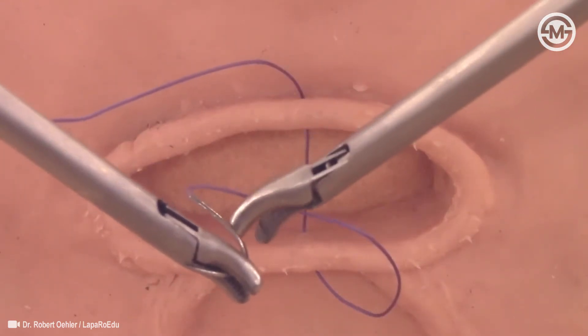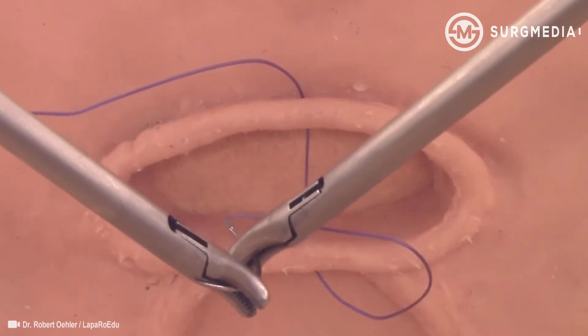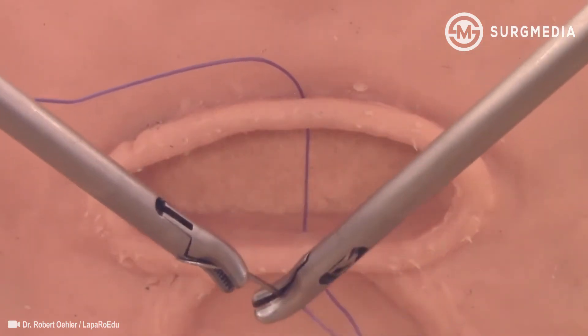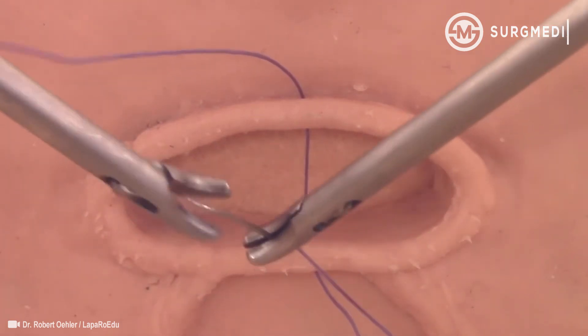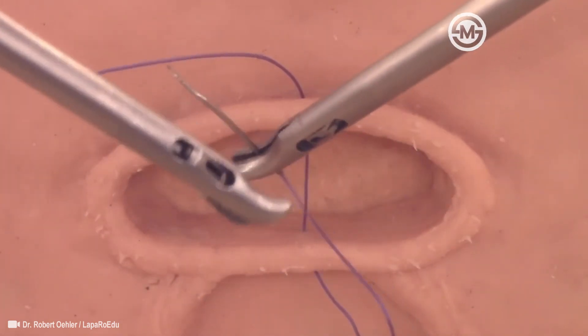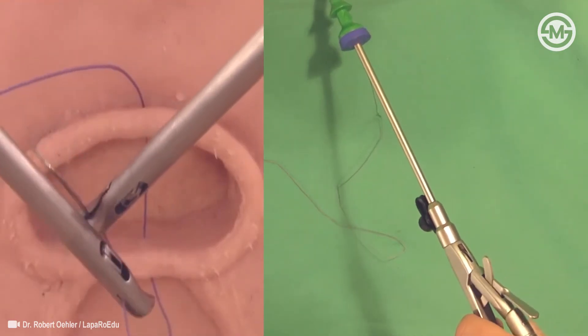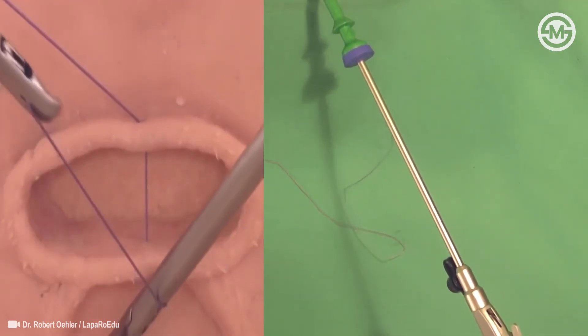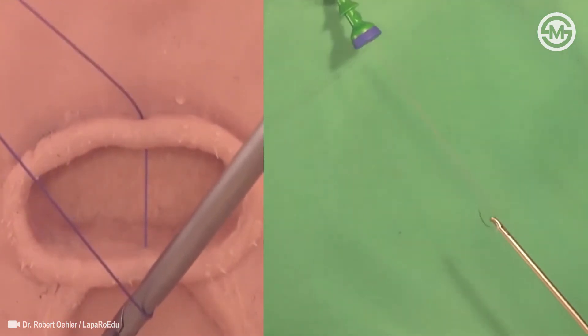Any large needle must be bent straight before extraction through the trocar. Forceful rotation of only the right needle holder will bend the needle sufficiently. The left needle driver now takes the thread. The closed right needle holder is placed near the exit point of the posterior stitch as a guide for the thread to avoid tearing the vaginal cuff. The bent needle can now easily be extracted through the 5mm trocar.